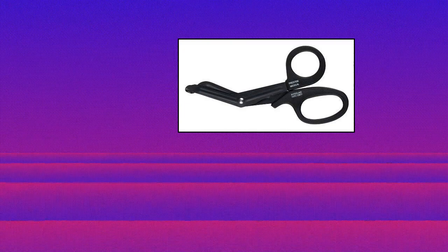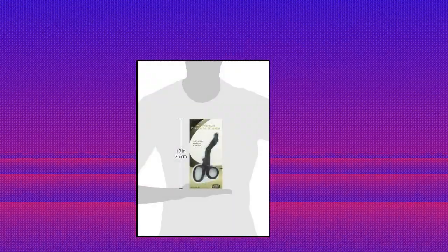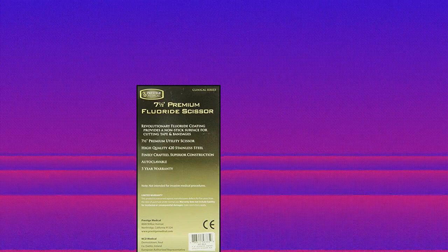Prestige Medical Fluoride Scissor, black, 7.5-inch. Features a revolutionary fluoride coating that provides a non-stick surface for cutting tape and bandages. 7.5 Premium Utility Scissor made of high-quality 420 stainless steel, finely crafted with superior construction. Autoclavable.